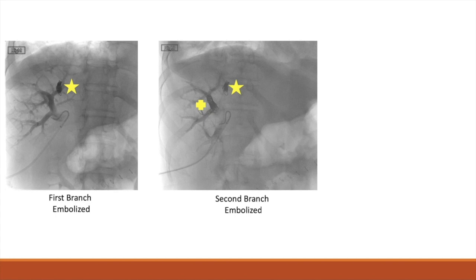In this slide, we can see the reverse curve catheter in position and embolic coils in both the first target portal vein (represented by the star) and the second target portal vein (represented by the plus). Note that the third portal vein branch to be embolized — the one that was accessed initially — has not yet been embolized.